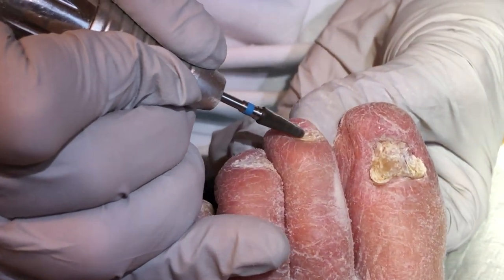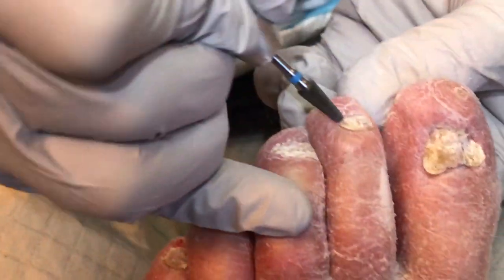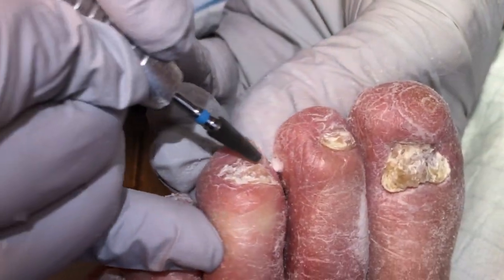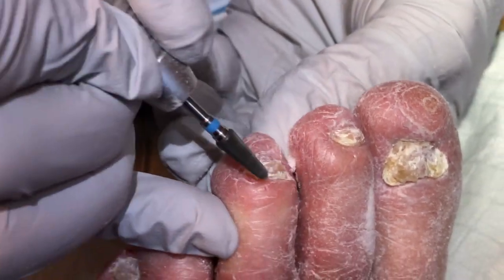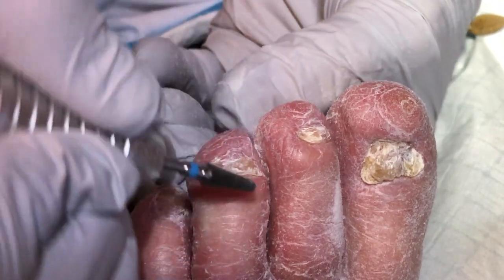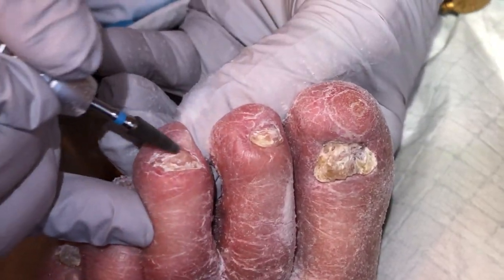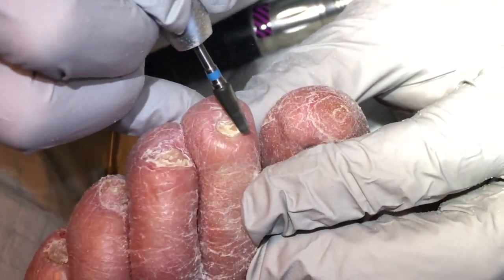Let's use the burr again to get into the little nooks and crannies because the other one was too wide. That's why I like having two drills — two different options. One of my drills is a 1/8 inch and the other one is 3/32. This is the 3/32.